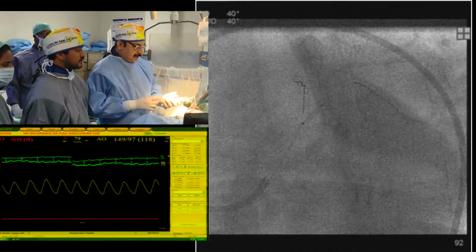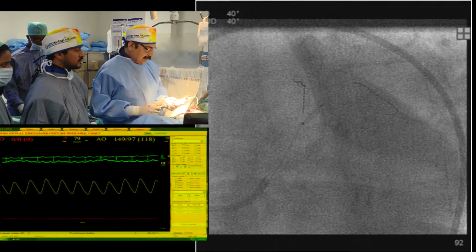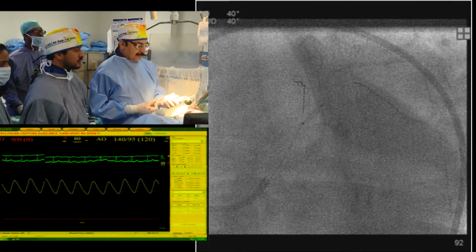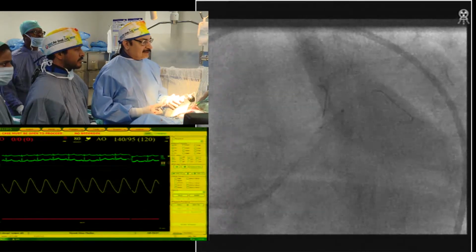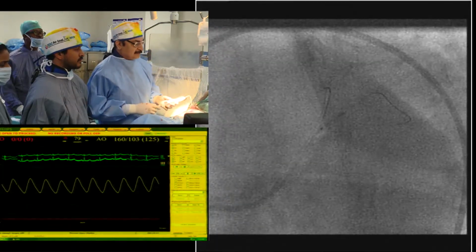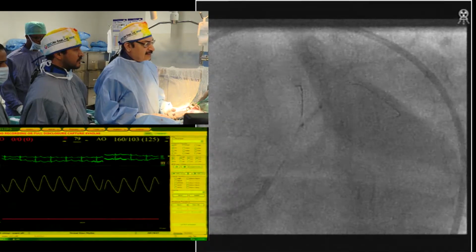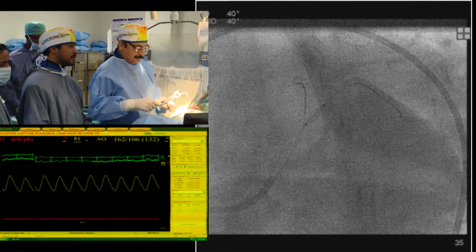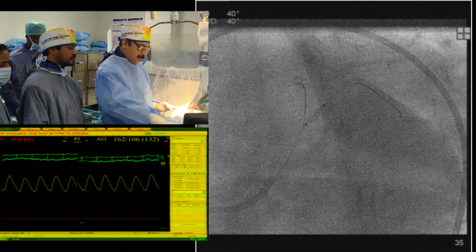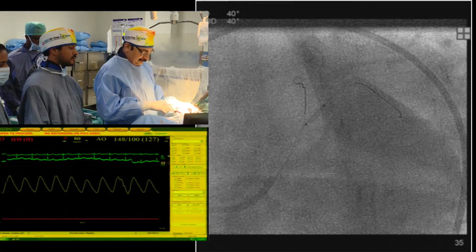So Ajit, in your practice, how long do you inflate this cutting balloon? Do you just dilate and leave it and come back, or are you there for some time, 30 seconds or 15 seconds? I would do exactly what you're doing now: go up slowly, hold it there for some time, come down slowly, because the importance is to remodel the vessel with the cuts. Correct. I don't think a hurry would help in this. Otherwise the advantage is lost.